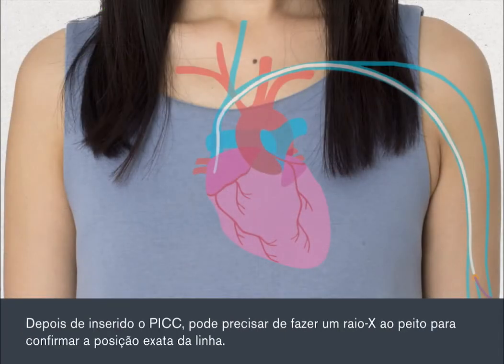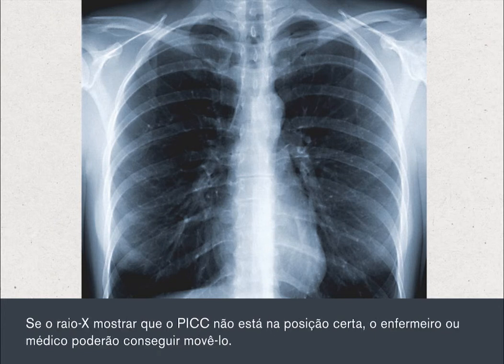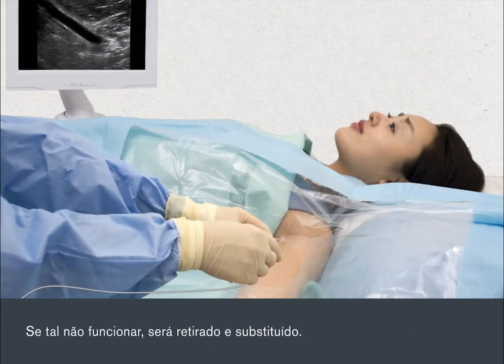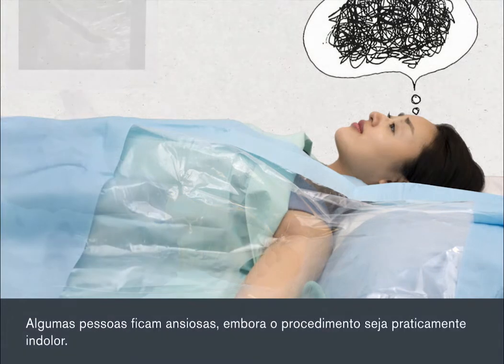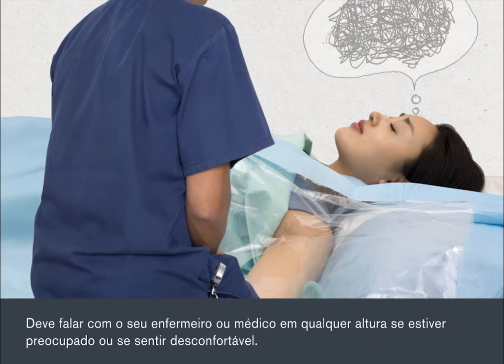Once the PIC has been inserted, you may need to have a chest X-ray to confirm the exact position of the line. If the X-ray shows the PIC is not in the right place, the nurse or doctor may be able to move it. If this doesn't work, it will be taken out and replaced. Some people do feel anxious, even though the procedure is almost painless. You should talk to your nurse or doctor at any time if you're worried or feel uncomfortable.